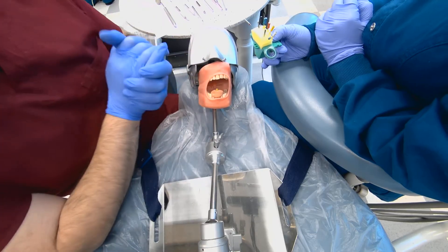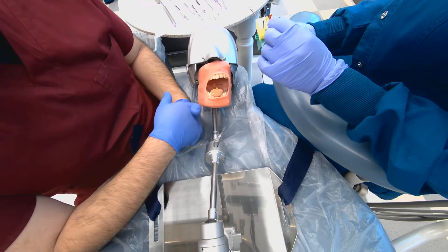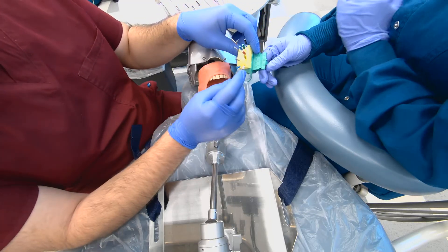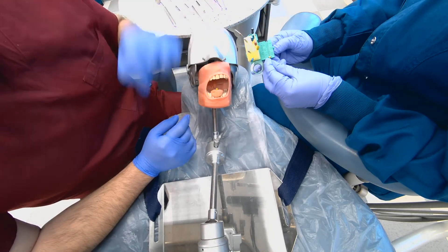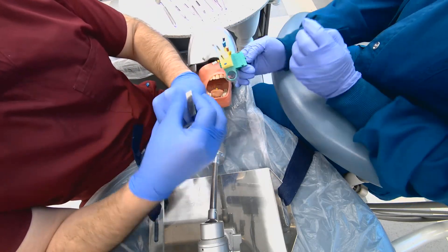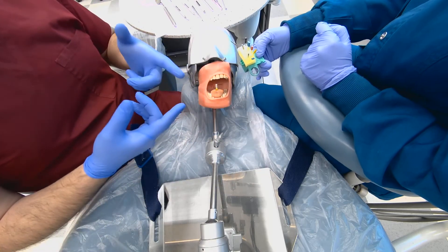Now that we've removed the pulp from inside the canal, we have to measure the working length. It's usually measured with an apex locator, but can also be done with an x-ray. So we put the file inside of the tooth — I'm going to ask my assistant to measure file number 15 on 20. The stopper goes in a little bit closer, and then we push it in and out. Dentists would wear their finger ruler, and then we check if it's the right size, put it in, and take an x-ray.